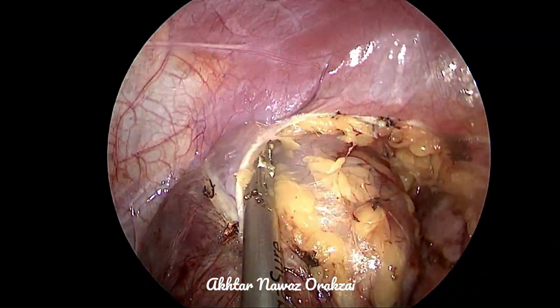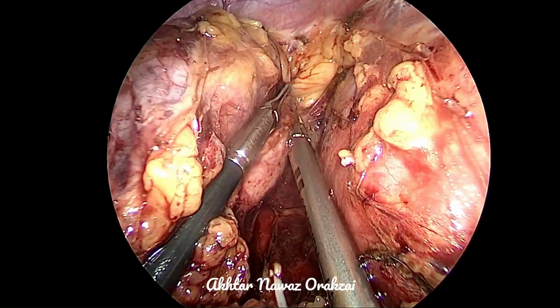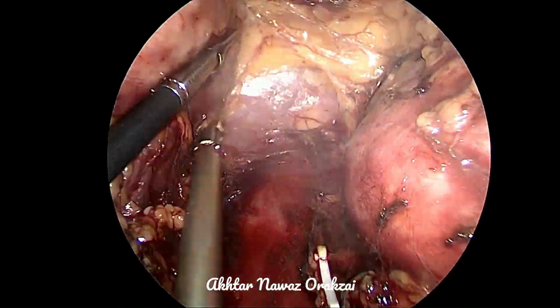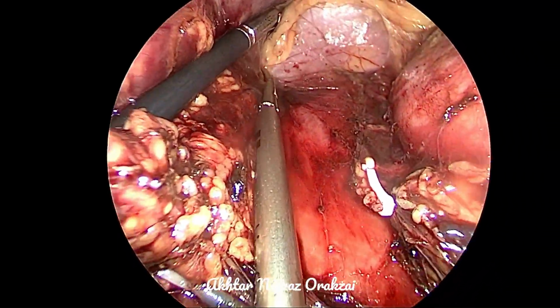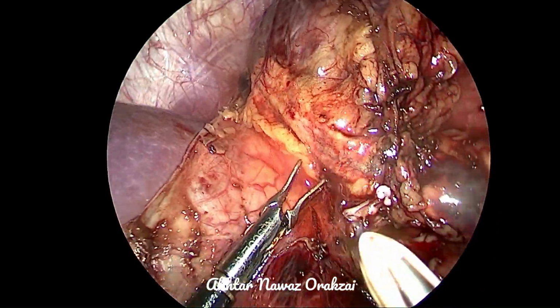Laterally, there is nothing much in the dissection. It is only fibrofatty tissue, but small vessels may also be there in that tissue. So care must be taken. However, the posterior dissection and the lateral dissection is almost complete.